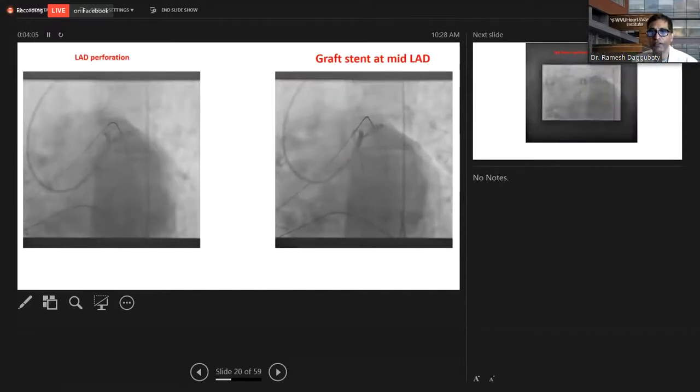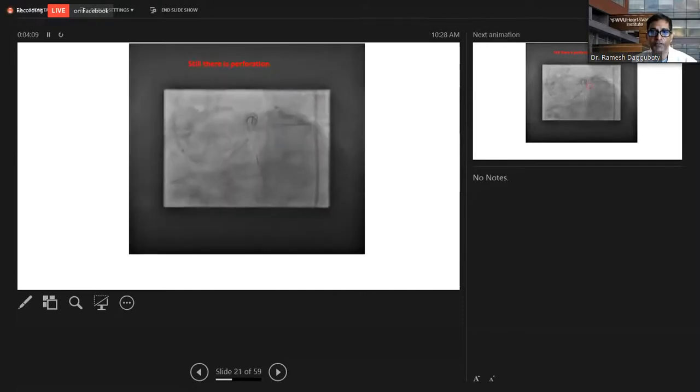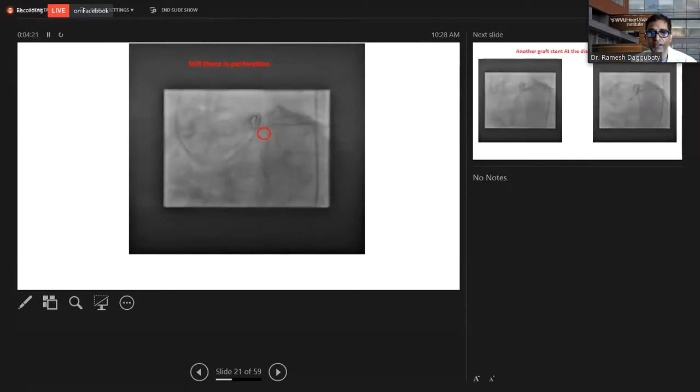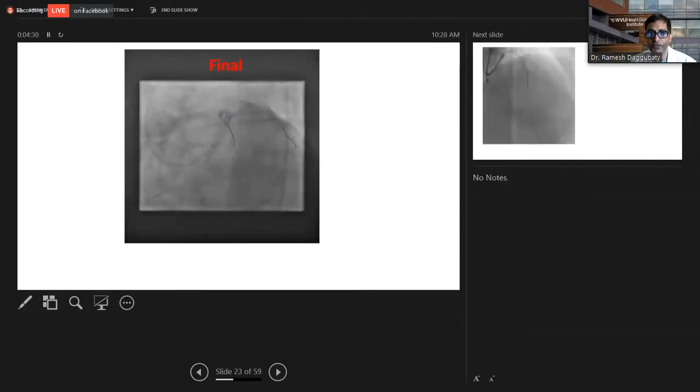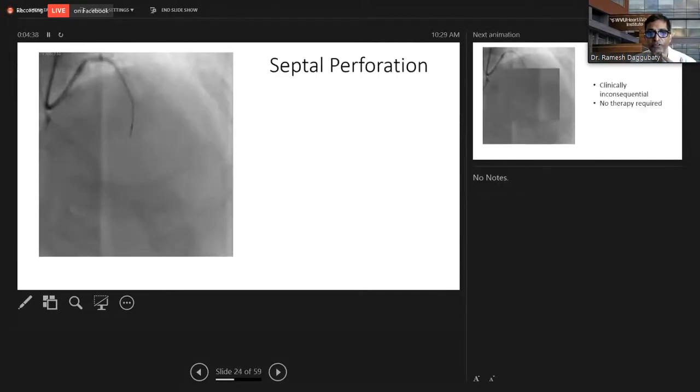So now it is very clear, this LAD perforation, balloon sealing was done, and a Graftmaster was placed, but still he has perforation going on. So where is the leak? The leak is probably a little bit more proximal, exactly at the carina, and that's where the marker is showing. So another Graftmaster was placed in the diagonal, and the balloon in the LAD, and that led to a good sealing. And this is the final picture where there is no more perforation or blush that you can see.